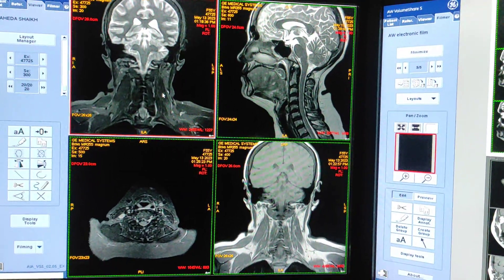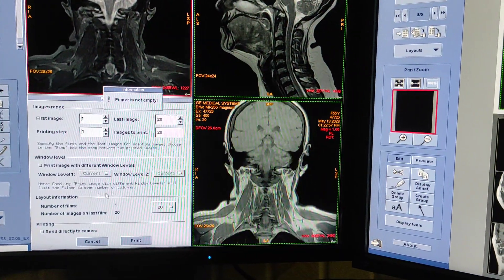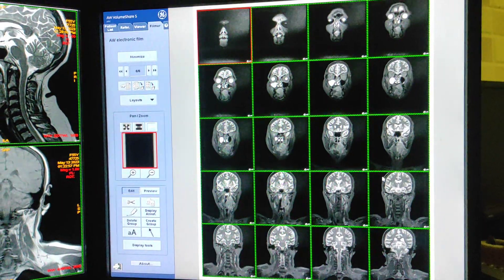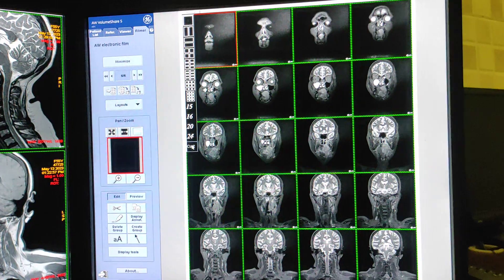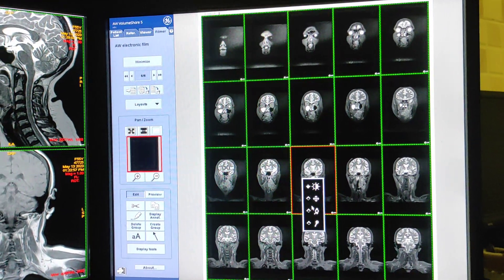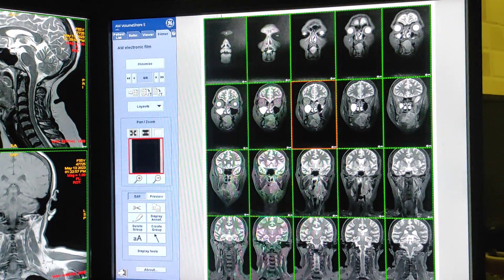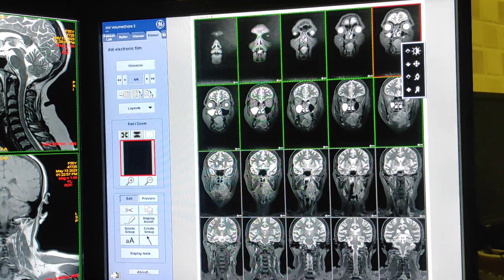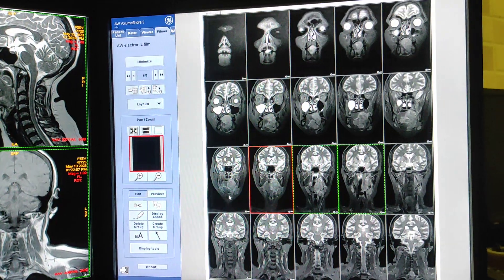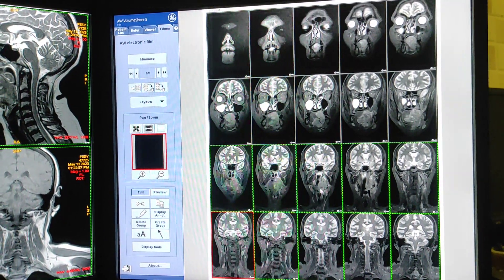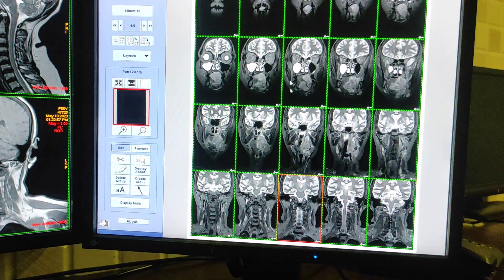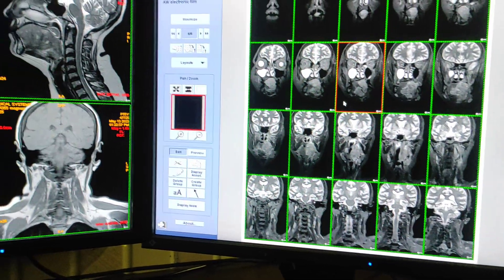Then I am going to give coronal STIR. Click on F4, click enter, and another film is ready. For this I am selecting a format of 5x4 — customized 5x4 instead of 4x5 — because I have to show the neck position. In the upper portion I will show only the tongue, and in the lower images I will show tongue along with the neck position, because the patient has lymph nodes in the neck position that need to be shown in the film. My second film, coronal STIR, is ready.